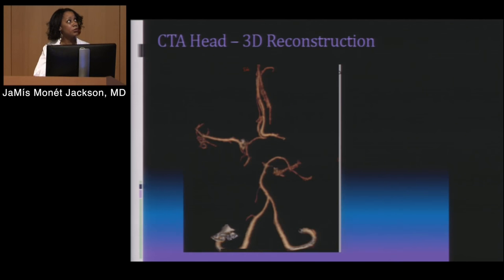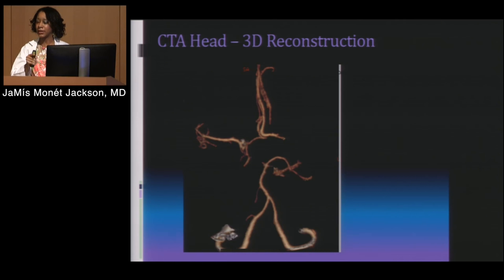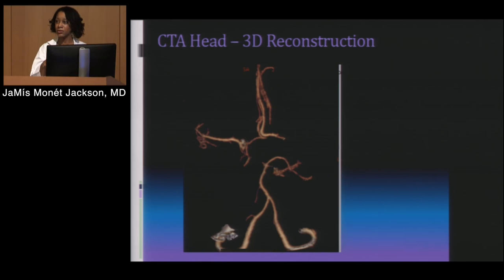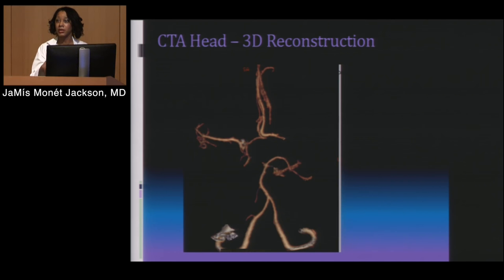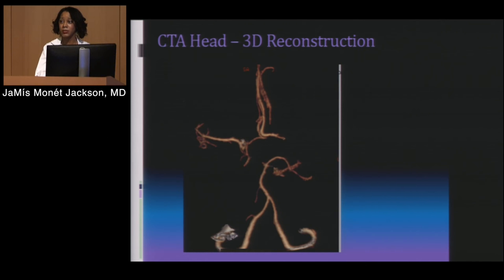This is a 3D reconstruction that we also look at in CTAs — just another way to visualize it. You can use the computer to turn it in all different directions to get better visualization of where there's actual loss of flow. It correlates with exactly what we just saw: there's no adequate flow there. She did have some, but not enough to properly perfuse that area of the brain. That's just another tool to help guide us with therapy and understand what's going on with the patient.